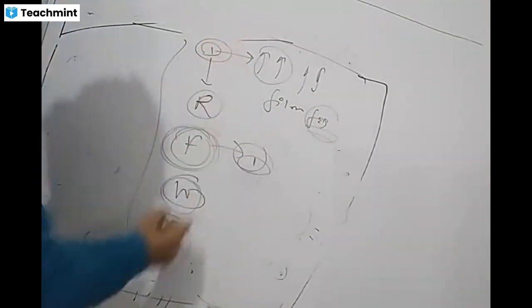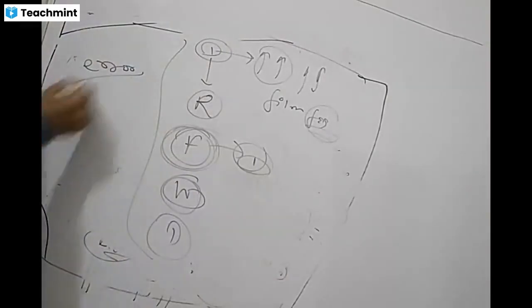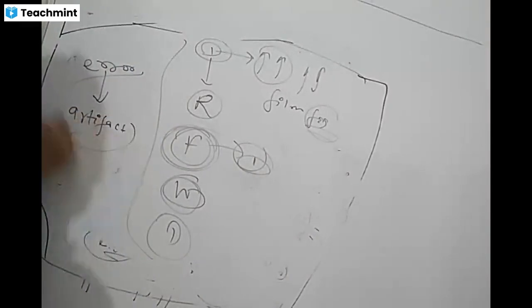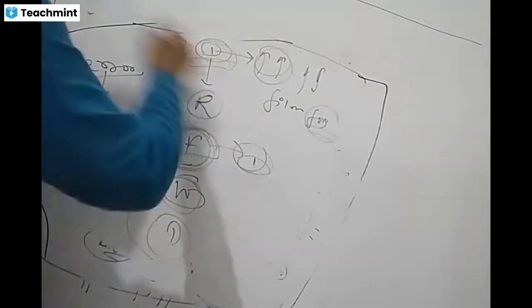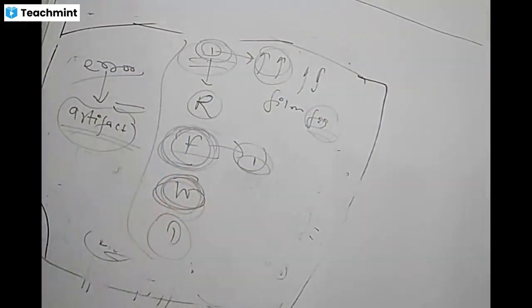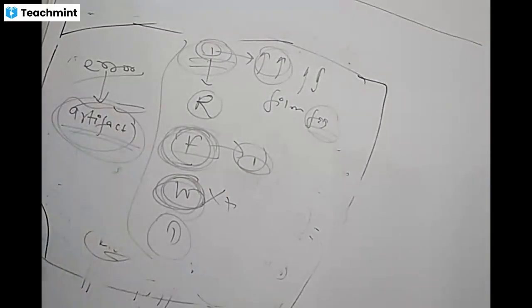If there is any error in these processes, that may lead to the formation of artifacts. So you can read the book: if we use high temperature, or old developer solution, or use the developer for a long time, which artifact will be there? If you are washing and some damage occurs, which artifact is there? So these are the artifacts.